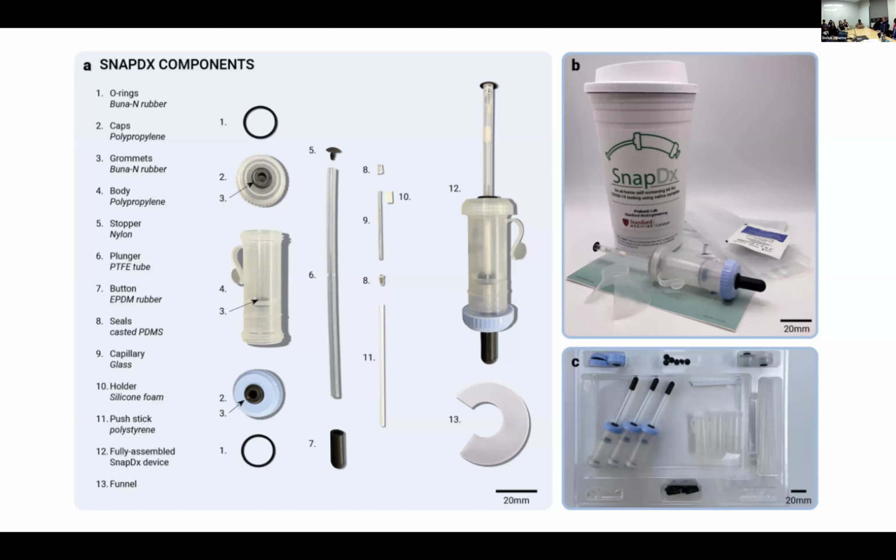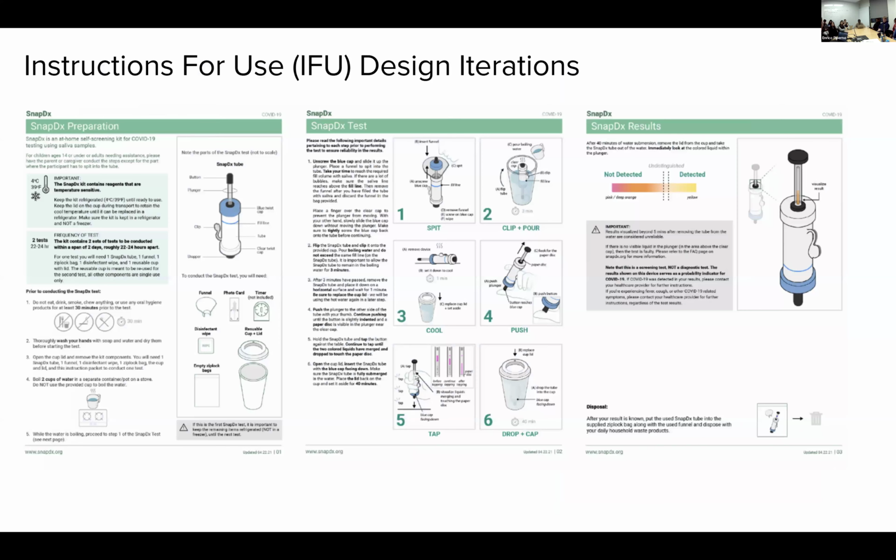And the device itself, there are many design criteria. You can maybe think of a few, where the parts need to be easily injection molded or easily attainable. They could be 3D printed. They could be found just at your local market or store. So things like that is what they were thinking about, especially since there were supply chain shortages during COVID-19.